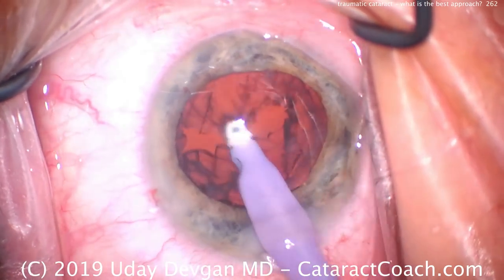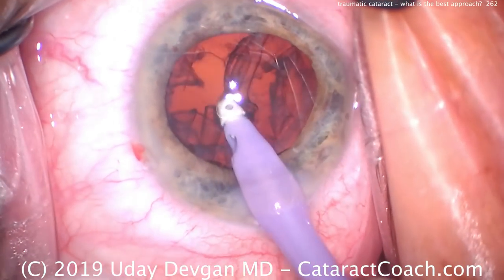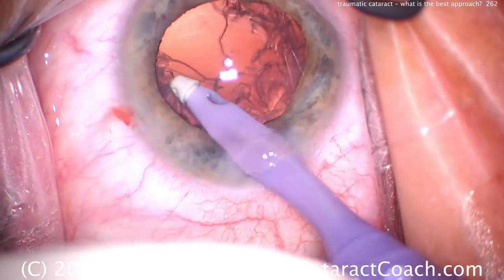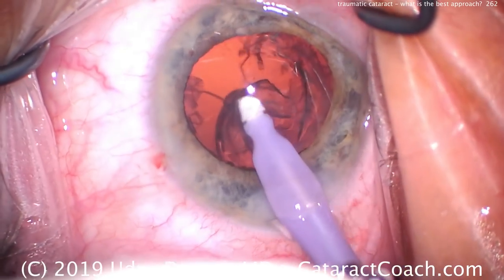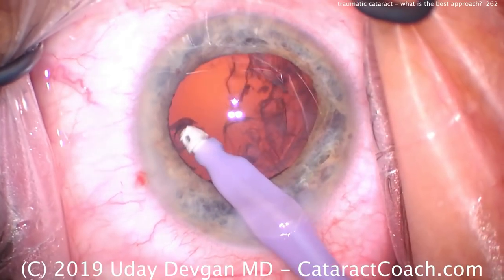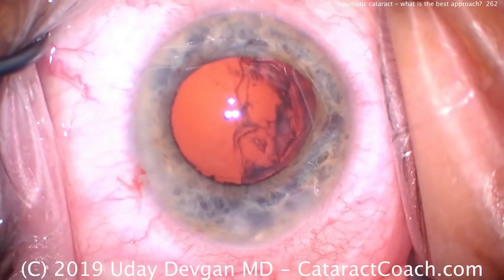So we'll do all of the cortex removal in the normal areas, the areas where there's no trauma. Nice and easy, taking that down, taking our time here. Removing this. Again, so far, so good. Very stable. Everything looks normal. I don't have any vitreous prolapsing around the lens equator. I don't even see any broken zonules.